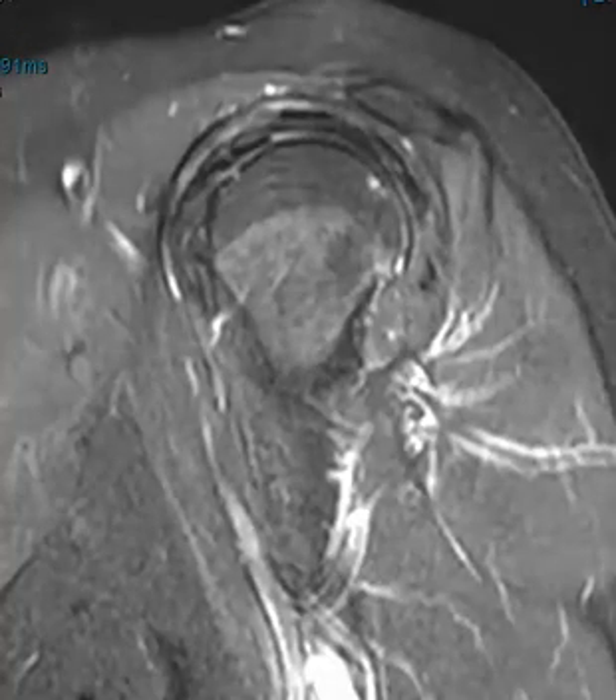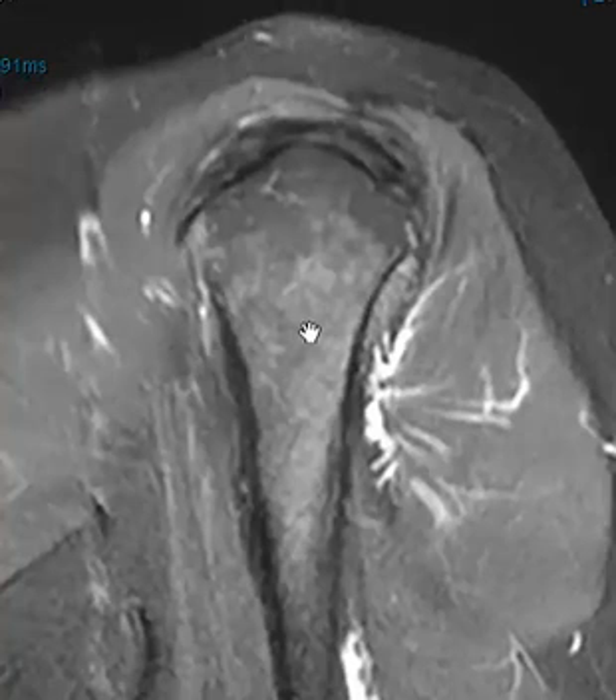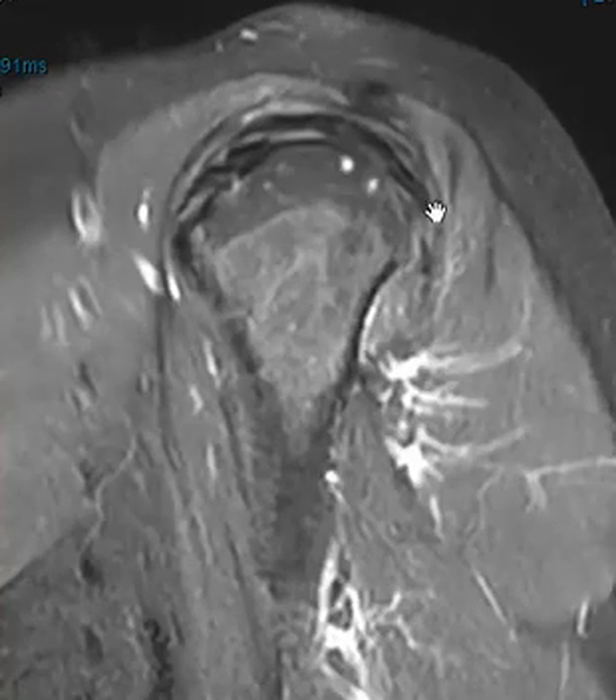Hello, this is Dr. Gay from FirstLake MRI. This is a 60-year-old female who has had shoulder pain for about three weeks. She's had prior surgery. She has a few findings, but we're going to look at the rotator cuff for this video.